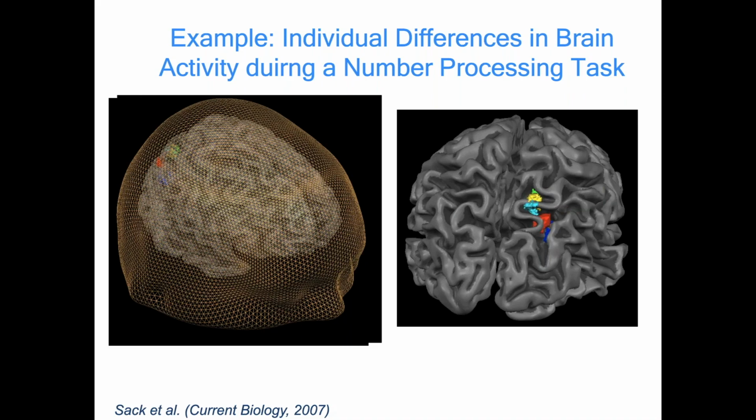And just to demonstrate this to you, very old research from our lab from 2007, in the context of a cognitive task, in this case, a number processing task, we first did the fMRI in a couple of subjects to identify the area in their brain, in their right parietal cortex in this case, that is most active when those people perform a number processing task. And you see here on the right, these 5 different clusters in different colors, blue, red, turquoise, yellow, green. Those are not different areas. Those are all the same area in terms of induced by the same task. These are just different people.